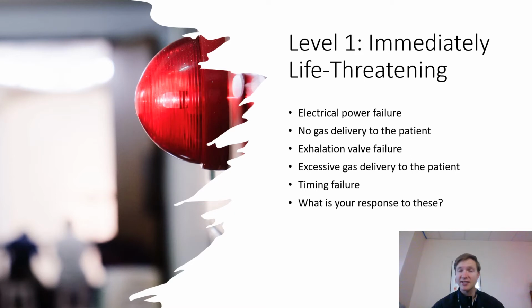If there's no gas delivery to the patient, in other words, we lost pneumatic power, we lost the pneumatic driving gas flow to the patient, of course that's going to be a life-threatening alarm, because now there's no breath delivery, there's nothing to help exchange the gas. If the exhalation valve fails, that's going to be a life-threatening one, because how is the patient going to completely exhale? How are they going to get rid of that gas? Excessive gas delivery to the patient could be very dangerous and cause a ventilator-induced lung injury.